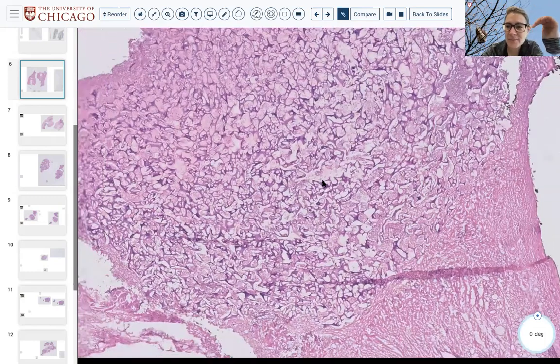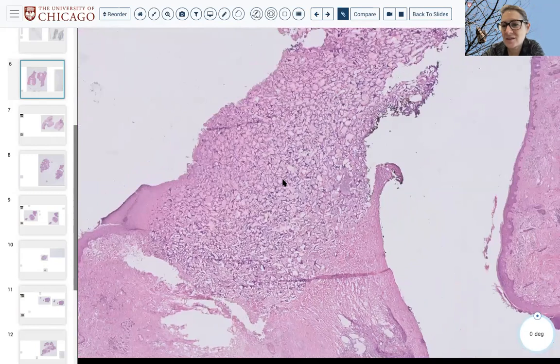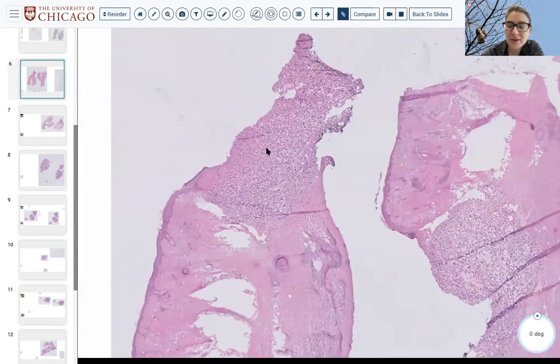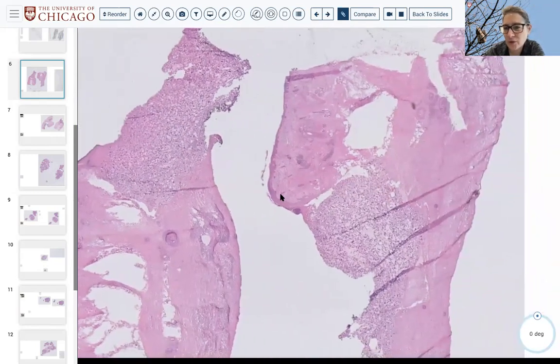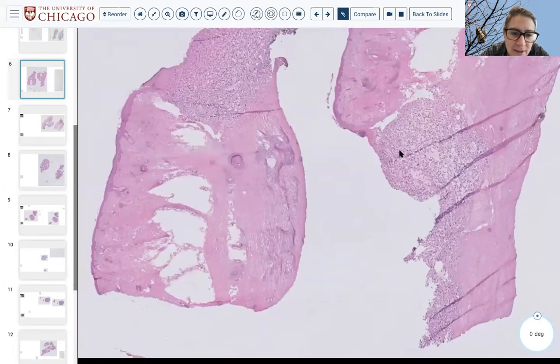So this patient has had a pretty significant resection of their skin for squamous cell carcinoma before, and this is packing material, right? So again, this is another potential pitfall of what you might see grossly, like that looks white, that looks weird, that looks like it could be a lesion. Okay, it's gel foam, exactly, it's packing. However, what else is there on this slide? Anybody notice anything else next to the packing?